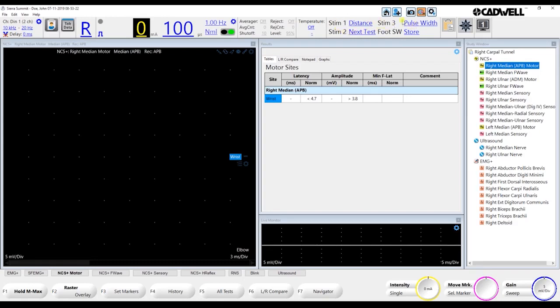I'm actually going to change stim 3 from pulse width to trace history, just to show you that it's pretty easy to make a change to this. So we're going to change this to history. And then if we want to make that a default change, all we have to do is edit save test parameters. Now we're ready to test.